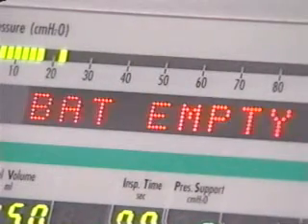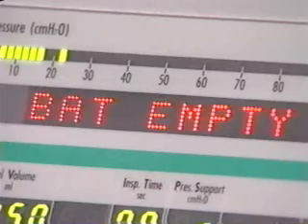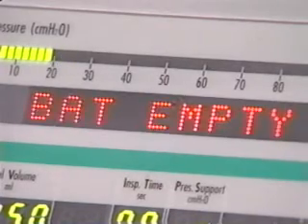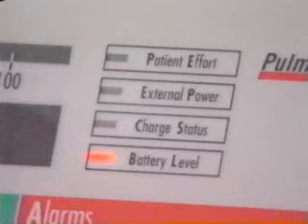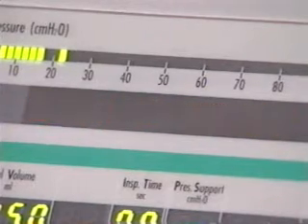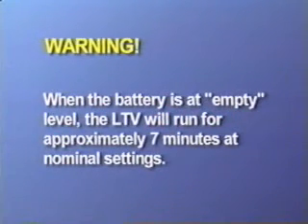The battery empty alarm occurs when the ventilator is operating from internal battery power and the battery charge level drops below the empty threshold. This alarm can be temporarily silenced but cannot be cleared. When a battery empty alarm occurs, the battery level LED is red, the battery empty message is displayed, and the audible alarm is sounded. When the battery reaches the empty level, the ventilator will run for approximately 7 minutes at nominal settings.